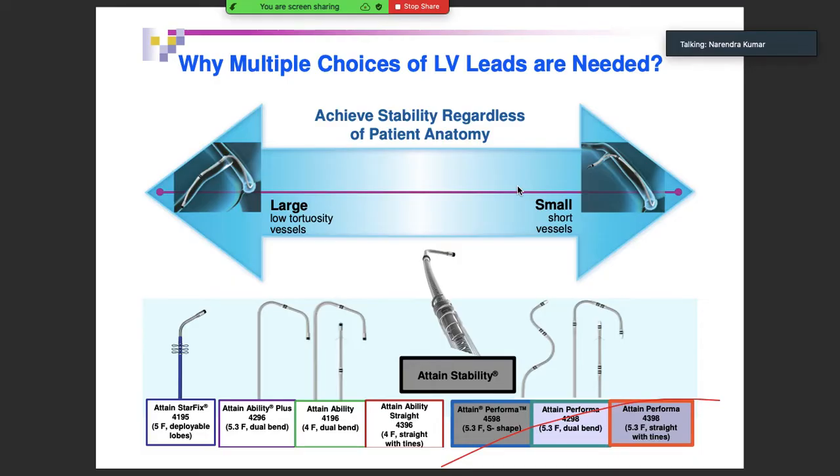Additionally, for the CRT IPGs, certain programming and device operations may not provide cardiac resynchronization therapy. So one should be really careful when you are using it, how you are using it. And sometimes rejection phenomenon can happen, erosions can happen as well. We should also be aware of the various complications, including the muscle or the nerve stimulation. There can be some oversensing or even failure to detect or terminate the arrhythmia episodes as well, or surgical complications like the hematoma, infection, inflammation, or thrombosis as well.